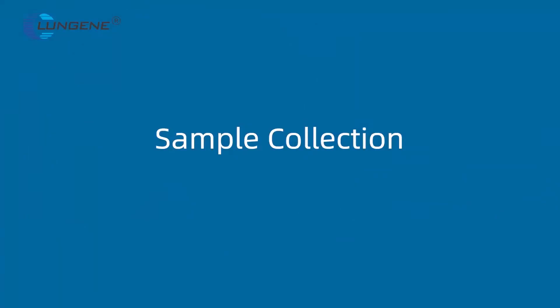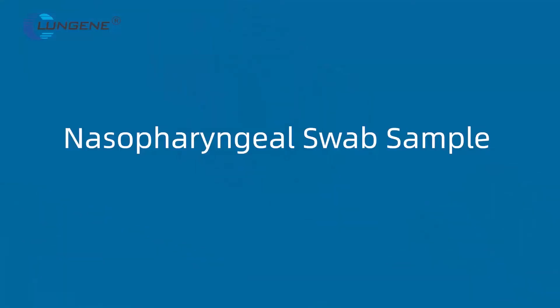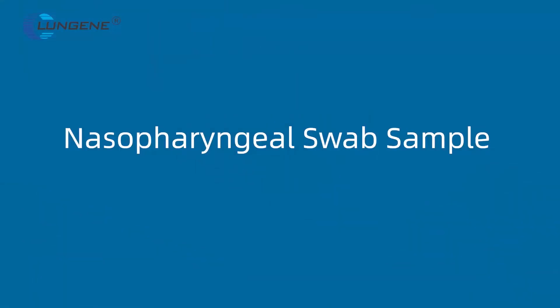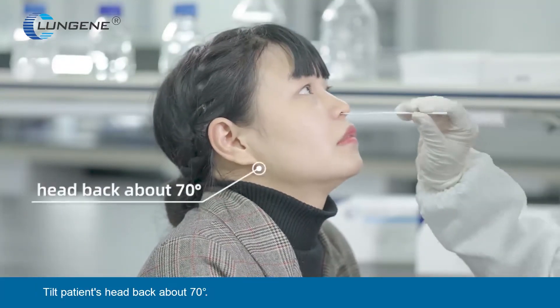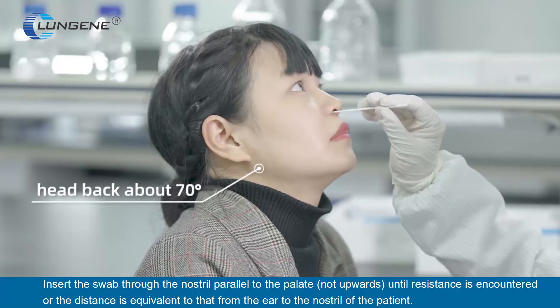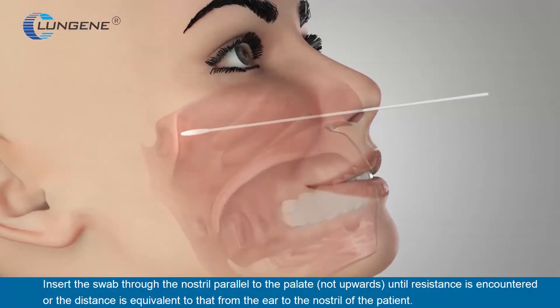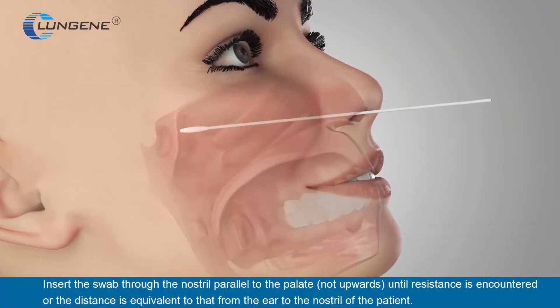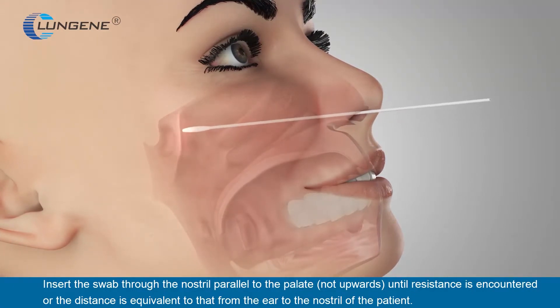Sample Collection — Nasopharyngeal Swab Sample. Remove the swab from the package. Tilt the patient's head back about 70 degrees. Insert the swab through the nostril parallel to the palate, not upwards, until resistance is encountered or the distance is equivalent to that from the ear to the nostril of the patient.